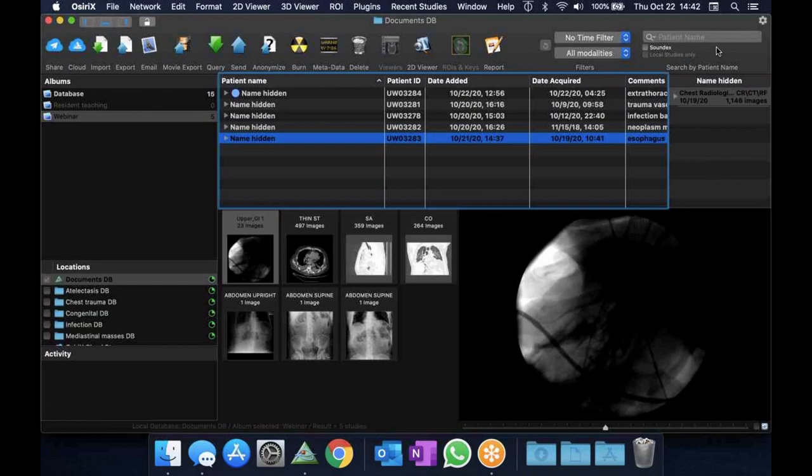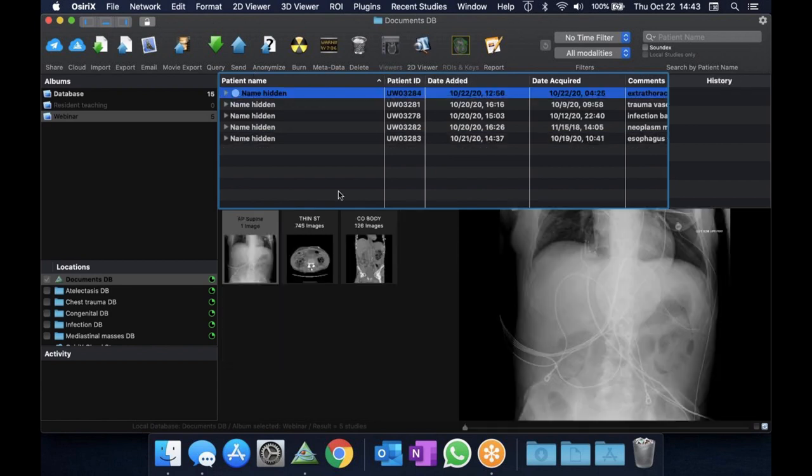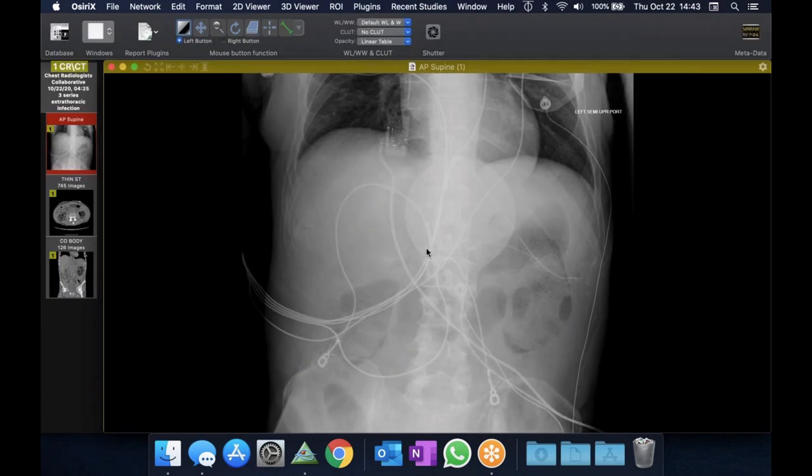Okay, so let's take a look. Let's see what I got here. So you see my screen okay? This is a non-chest case, but it's something crazy I came across today when I was looking at a chest radiograph and noticed, on this abdominal radiograph, that there was a funny looking gas collection in the abdomen.